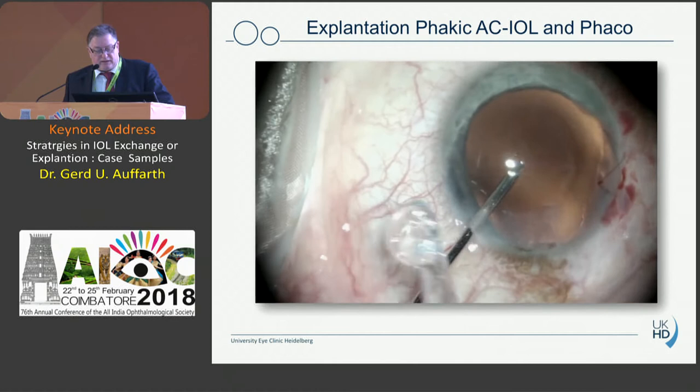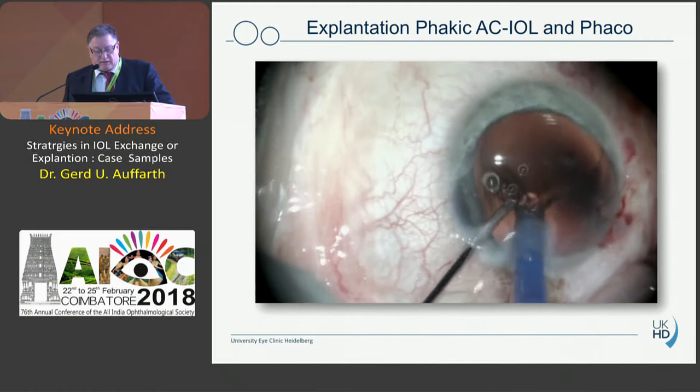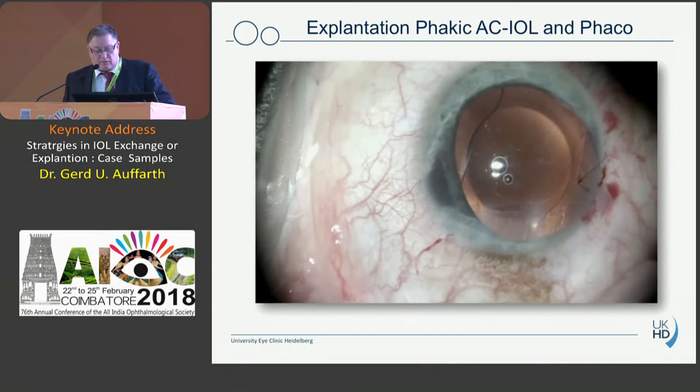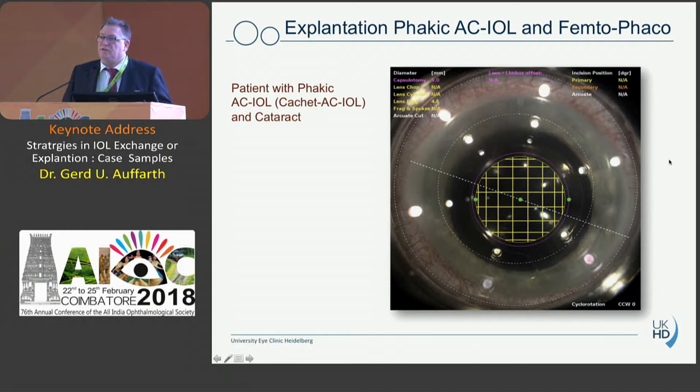We put a 10-0 nylon suture and proceed to FACO. This is a myopic patient so there is a deep anterior chamber and a more cortical cataract, which can be removed quite easily. Then I implant a lens without viscoelastic, just under irrigation — it's a hydrophilic lens from Zeiss — so the chamber is open with irrigation and the lens goes directly into the capsular bag. You don't need to remove viscoelastic because it was implanted under irrigation. This works quite well.